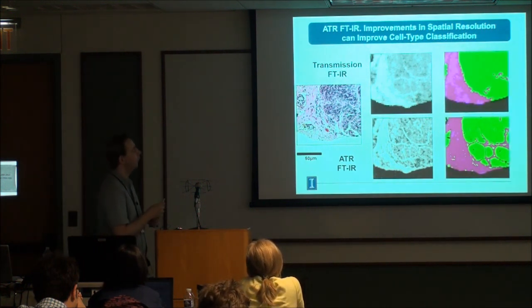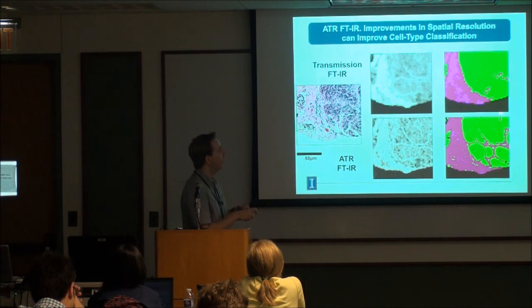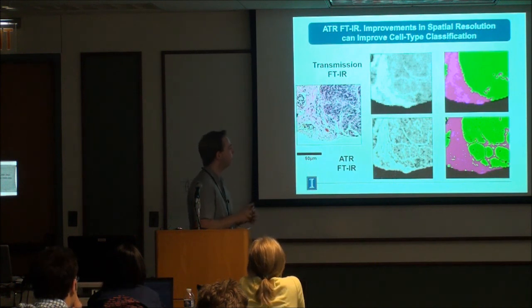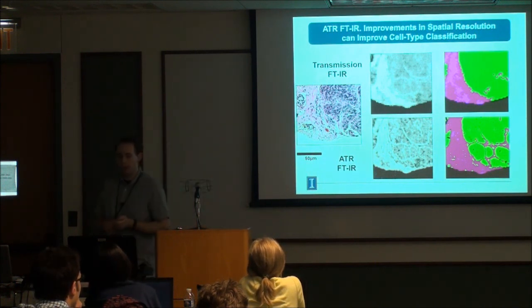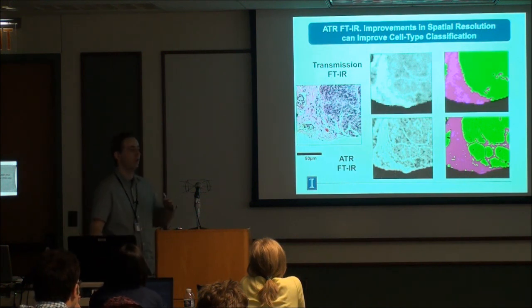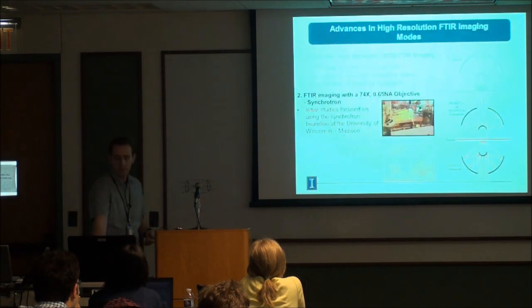So you can now see, if you're using a cancer classifier, that you can segment out the intralobular stroma from the epithelial cells. So this is really important. What we're working on now, or Sri is working on now, is developing a high resolution classifier which can take these new cell types into account.